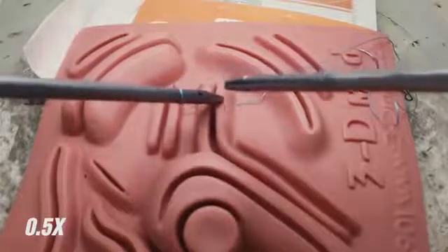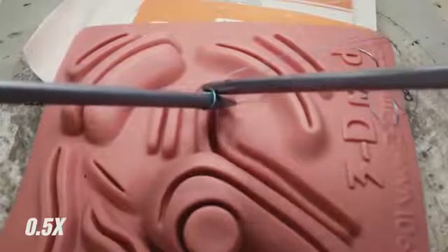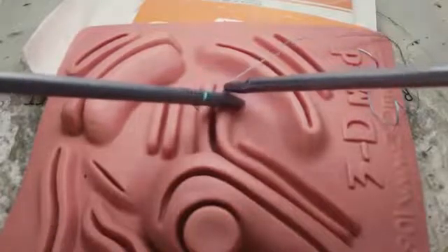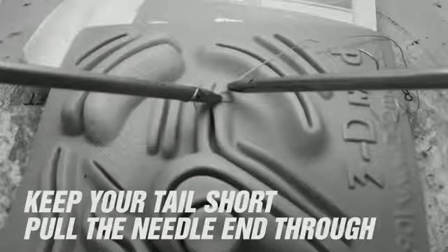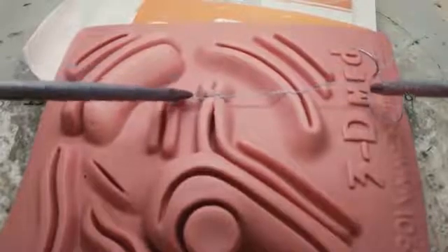Repeat the exercise to create a surgeon's knot. Grasp the tail with your hand pronated so that if your tail gets stuck in the knot, you can supinate your hand to flip the tail out. Begin snugging down the knot by pulling only with the needle end — this ensures your tail stays short.